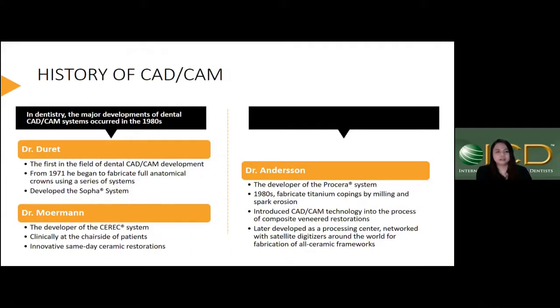for CAD/CAM, I will go back to history. In dentistry, the major development of dental CAD/CAM systems occurred in the 1980s.